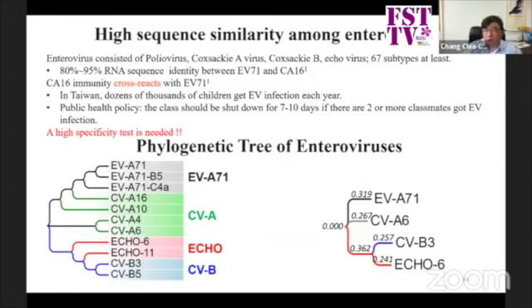As I mentioned previously, enterovirus disease sensing is important, and typing is also important. We can detect the different types of EV71, and this data is in revision and will be published soon. People found that EV71 may have high sequence homology to Coxsackievirus A16 and A6.